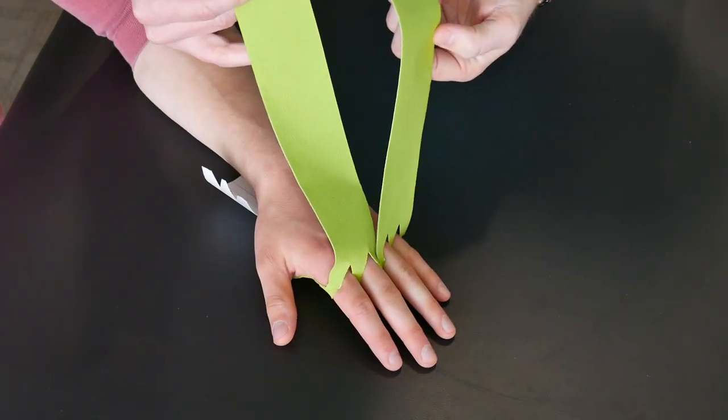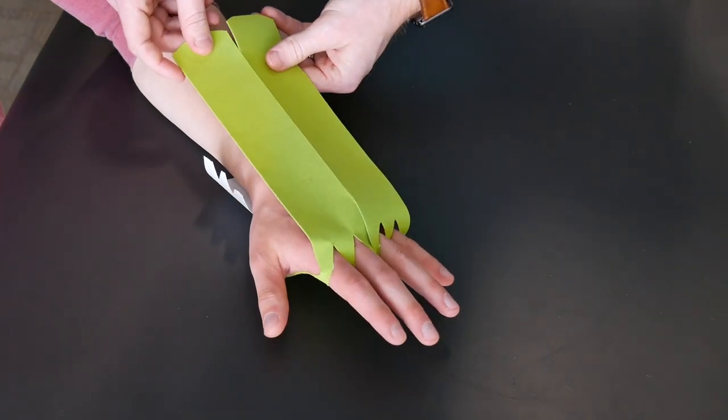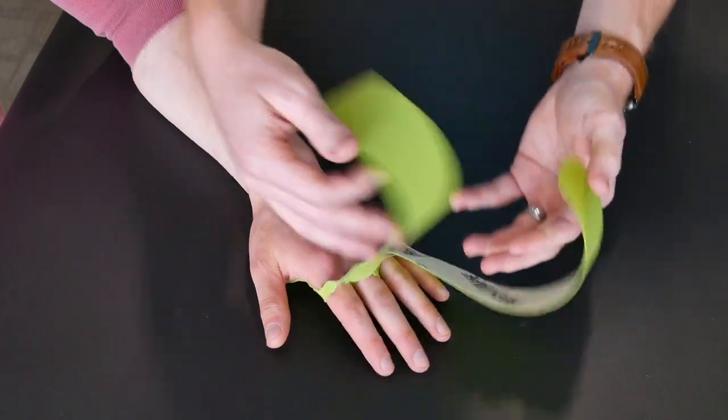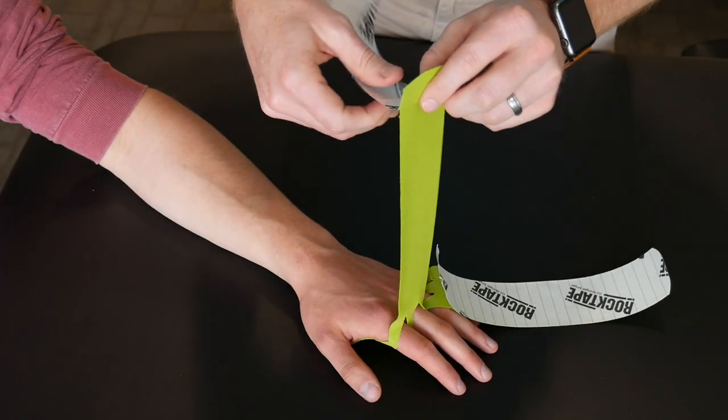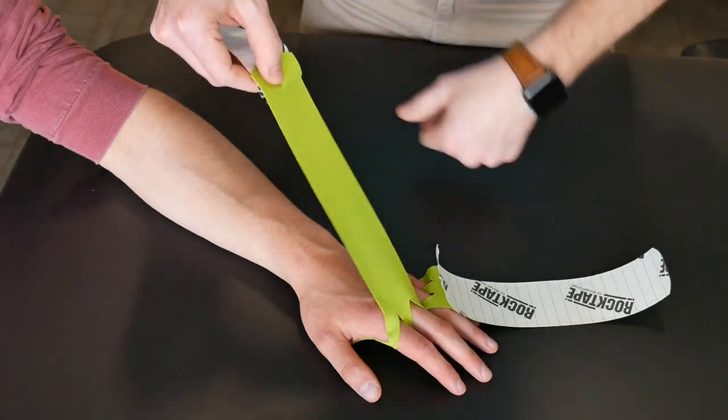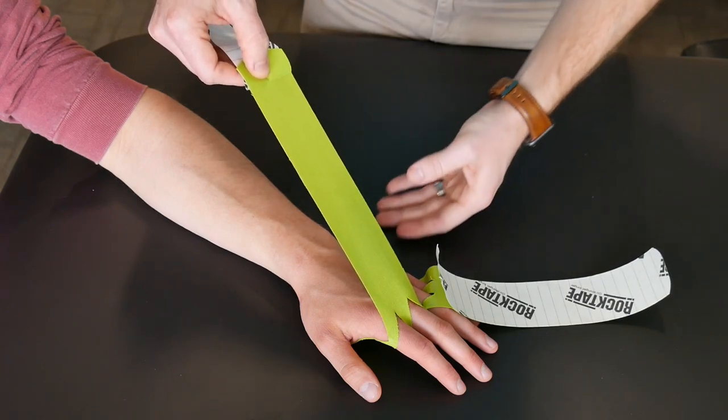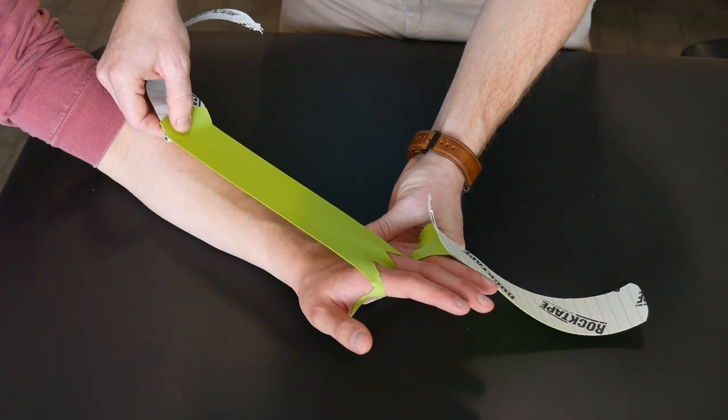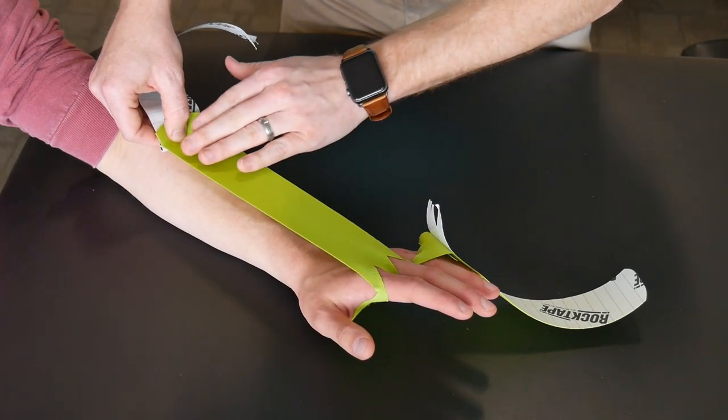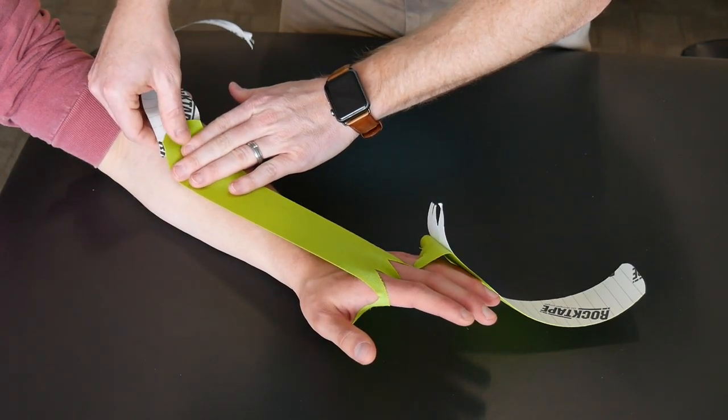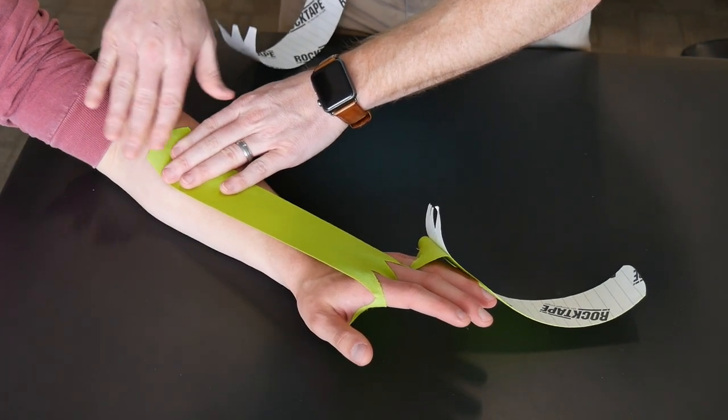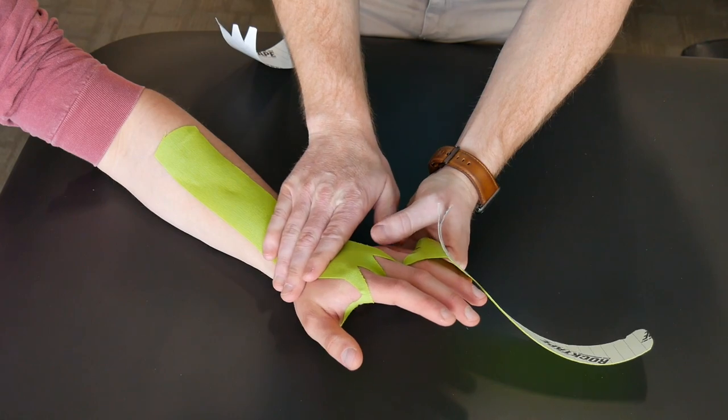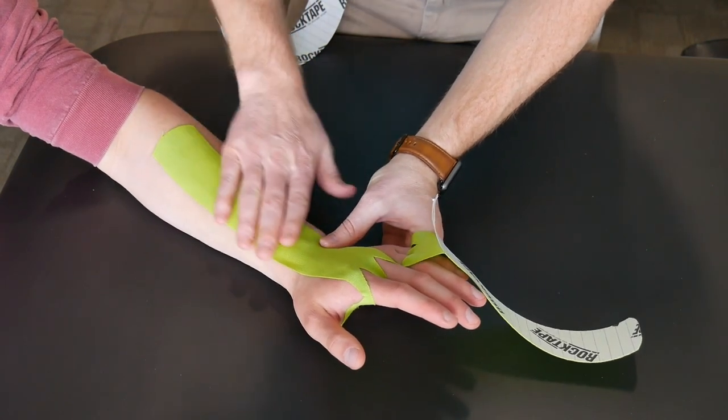All right, so now you've got your two strips on the back and this will be the main thing doing the work to facilitate that wrist extension. So go ahead and pull all of the back of that tape off except the last inch or so so that you can have a handle to pull with. If you pull their wrist into slight extension it is going to hold them up slightly better than if it were in neutral and then you'll go down the line and rub that in.